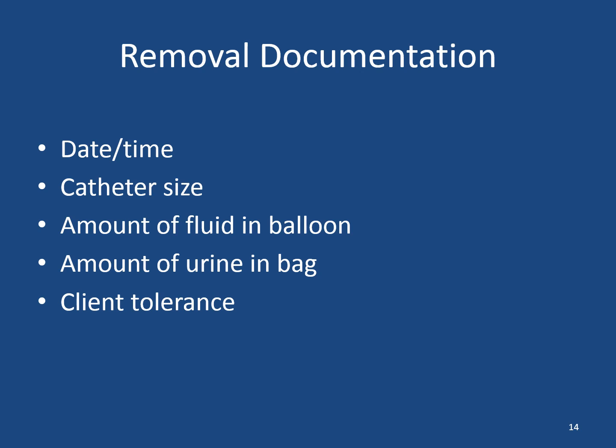Once it's filled up, you would actually empty it out, reattach it, and make sure you get all the solution out. The reason I say this is sometimes somebody might say that they put in 5 mLs or 10 mLs, but what's actually in there is significantly more, and you don't want to start pulling that catheter out if the balloon is still full. So make sure the balloon is completely empty. Then you have a washcloth hanging out right over their peri area. As you remove the catheter in a smooth motion with the washcloth, you can catch the end to make sure that it doesn't drip anywhere. I also always recommend emptying the drainage bag before you start this process. It'll just make your life a little bit easier, especially if it was really full.